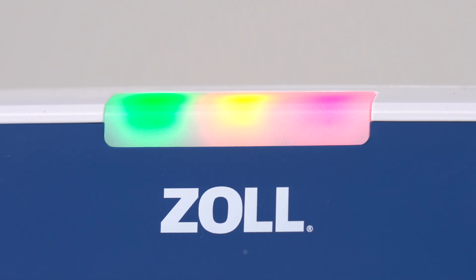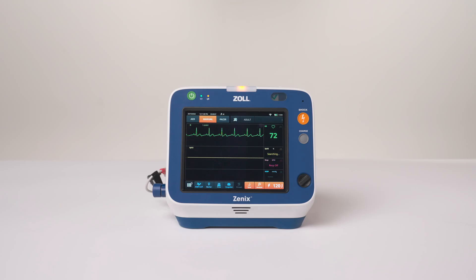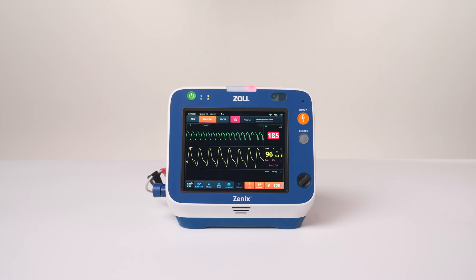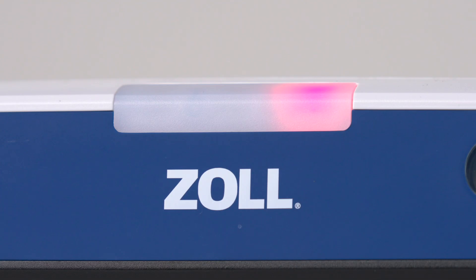On the top of Zenix are three LED indicators. Starting from the left, they are green, yellow, and red. Green indicates data transmission. The yellow and red LEDs are visual alarm indicators and are accompanied by both audible alerts and messages on the Zenix screen. Yellow indicates a medium priority technical alert, visible in situations such as a disconnected ECG lead or when the printer has run out of paper. Red indicates a high priority patient alarm that requires immediate attention, such as low blood pressure or a life-threatening arrhythmia.